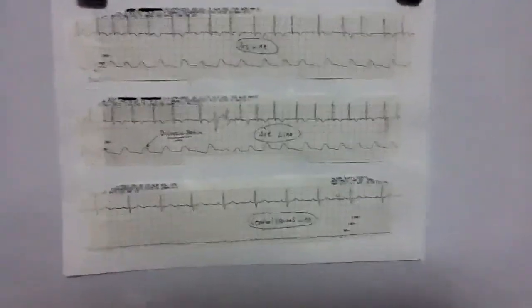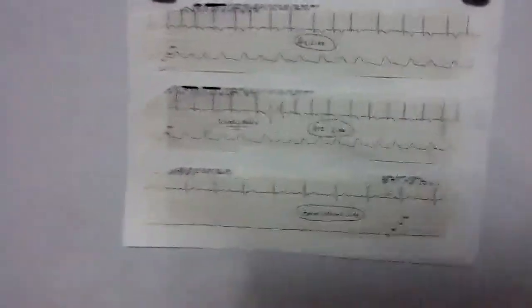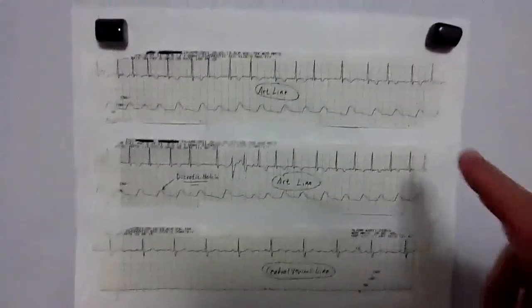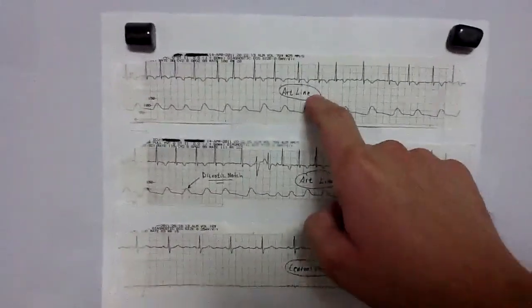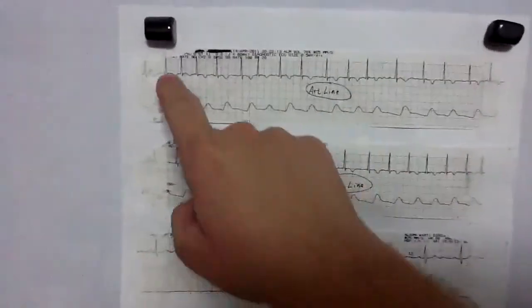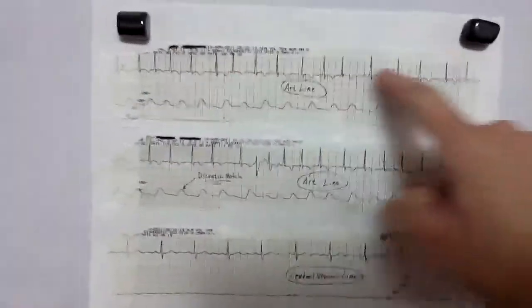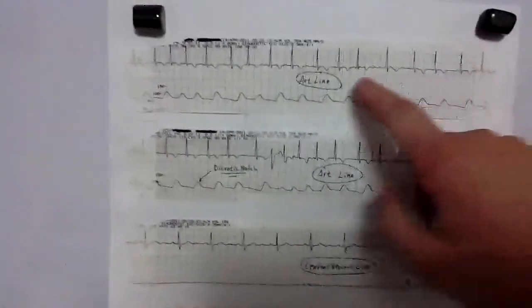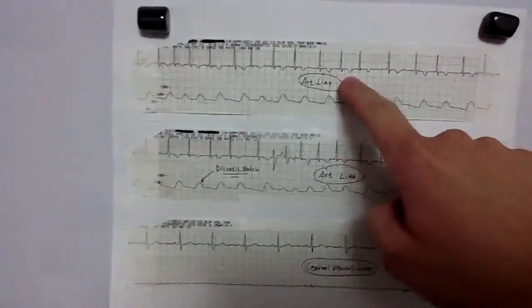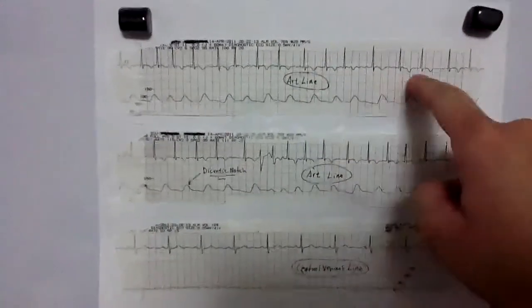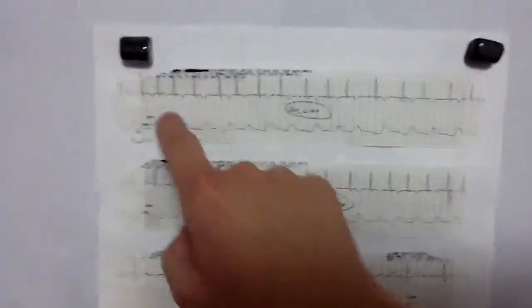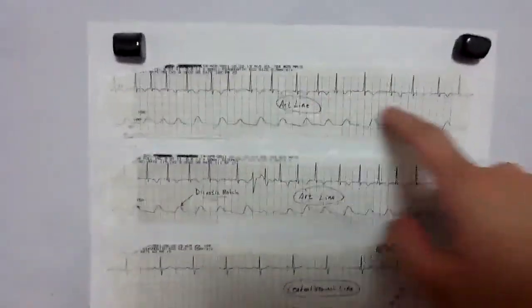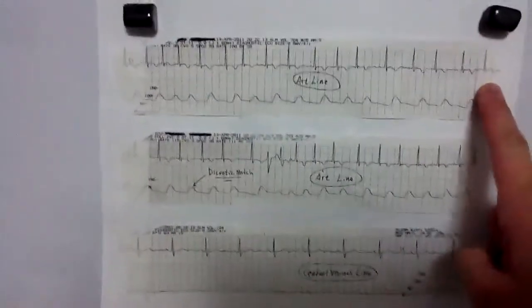What I want to show you here is, if you can see on the top, I obviously have an ECG. You can see that there are some T-wave inversions here, so obviously this is some sort of underlying cardiac issue going on with this patient.